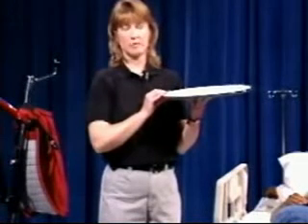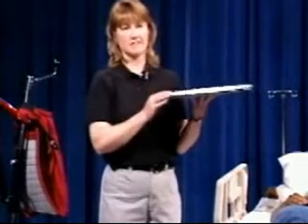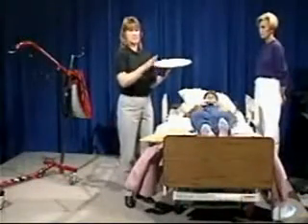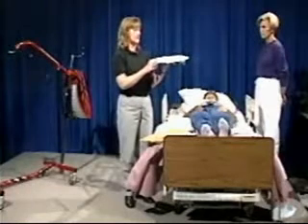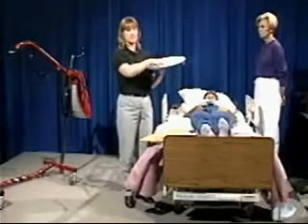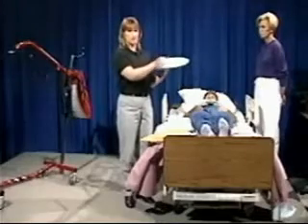This is something that is used on patients who are not able to do a pivot transfer very well, or who need a lot of assistance with a pivot. They can't move their legs to get from the bed to the chair. They may be stumbling over their feet, and it is just safer for them to have their feet on a disc that will pivot as you transfer them.